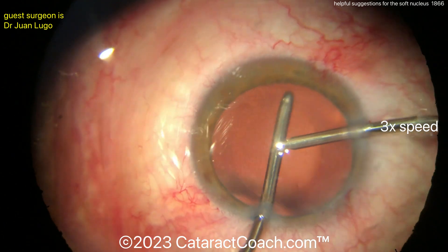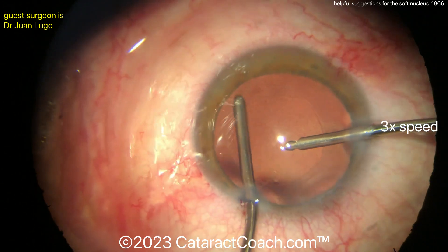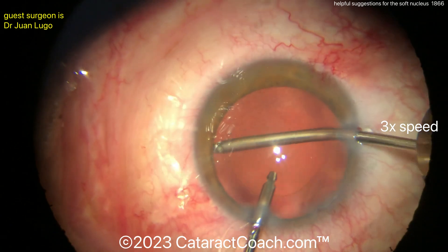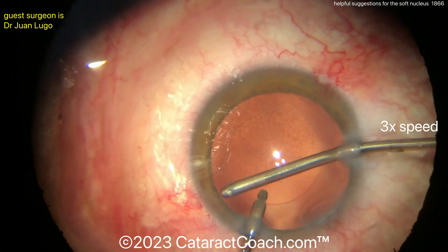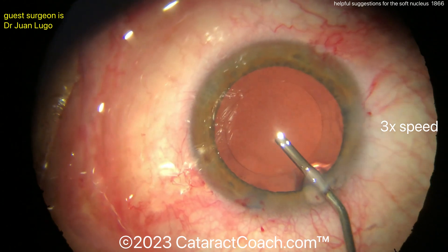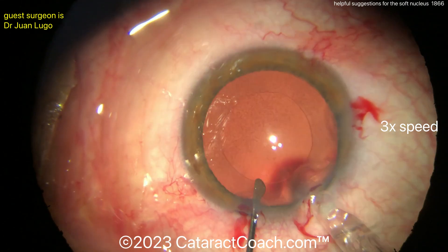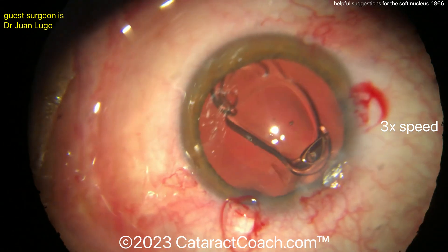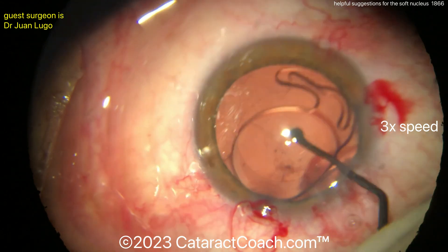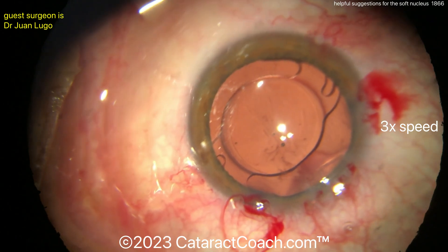Just doing a little capsule polishing there — that looks beautiful. It's a very nice outcome. That rhexis especially looks great. Look how it's right in the middle of those Purkinje light reflexes — this will be a beautifully centered lens. Now filling up the bag with some viscoelastic, and here's the lens going in — looks like a single-piece acrylic lens going in the capsule bag. Look at that rhexis — it's beautiful.